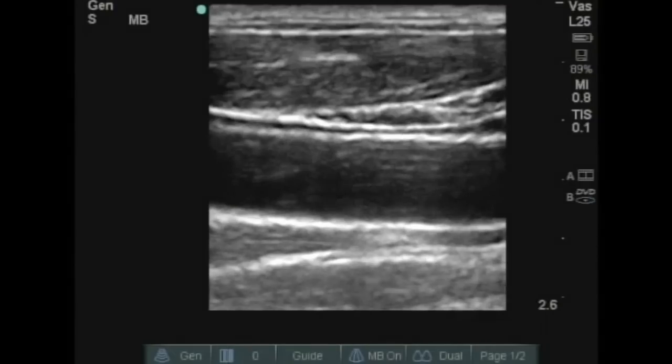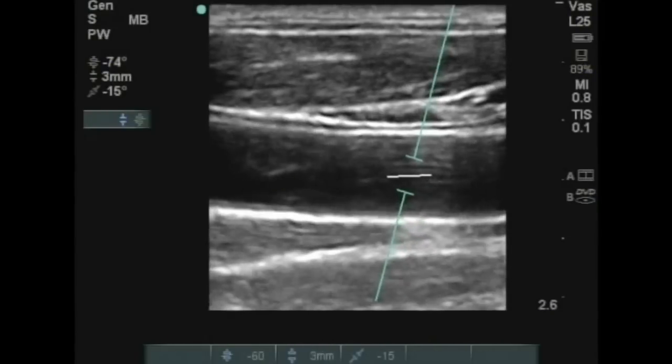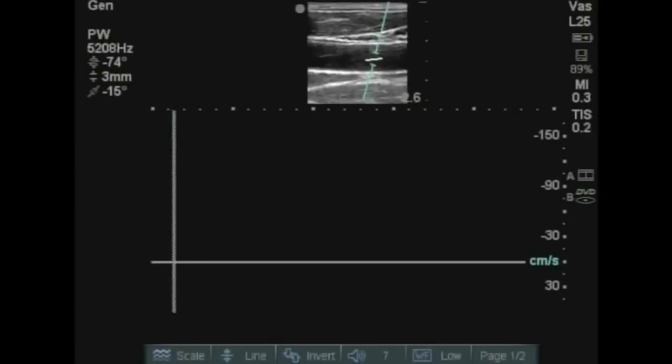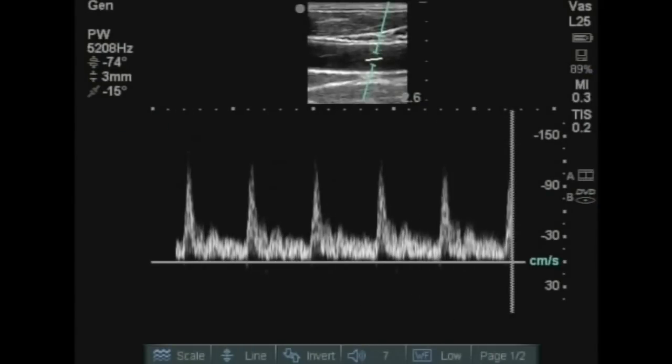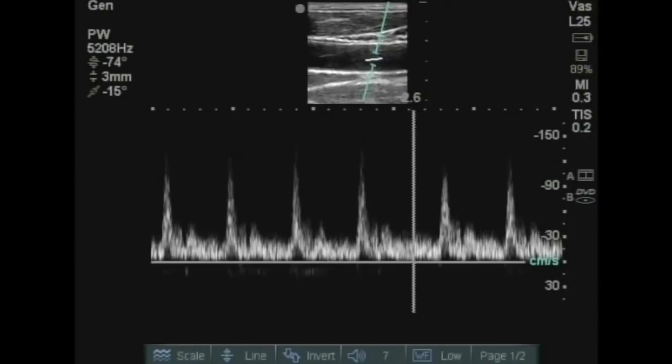Spectral Doppler activates the spectral spike, where you would place that in the area of interest in the gate, the area between the two horizontal lines. And what's going to happen is the system will look for motion through that gate, and it will plot it as a waveform. So it plots all the reflectors or blood cells moving through that gate over time. And this is what we commonly see for arterial and vascular studies.